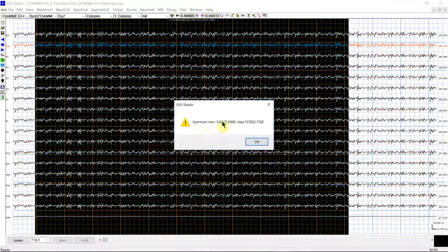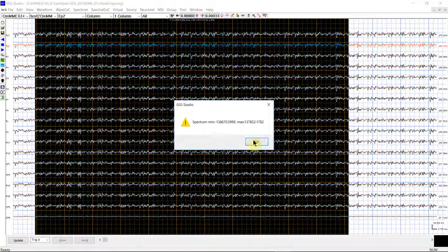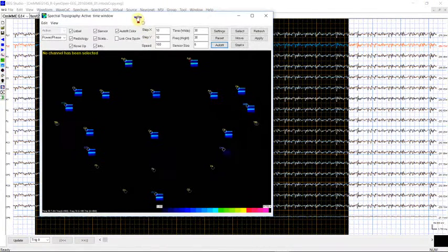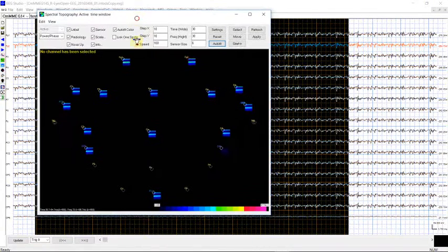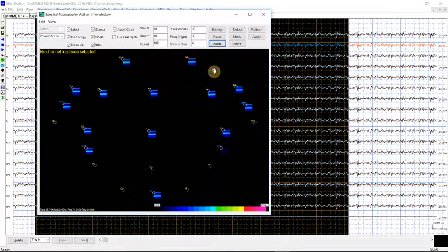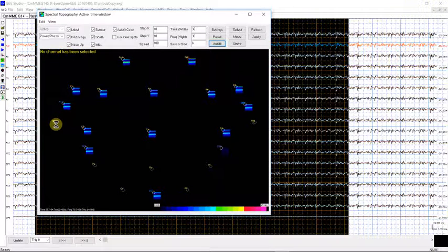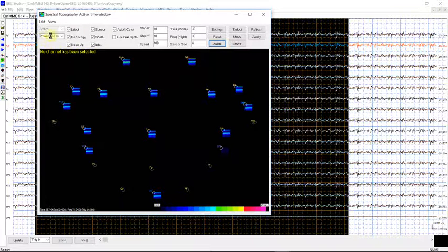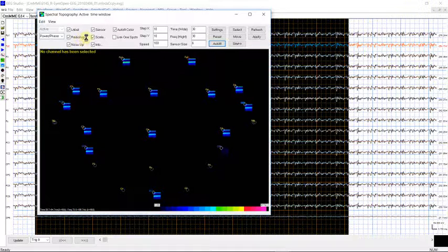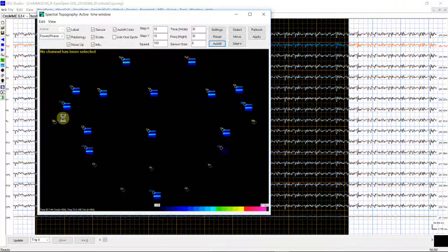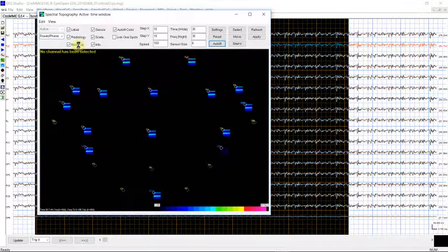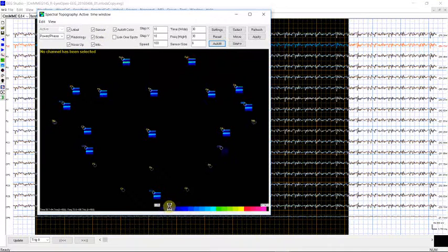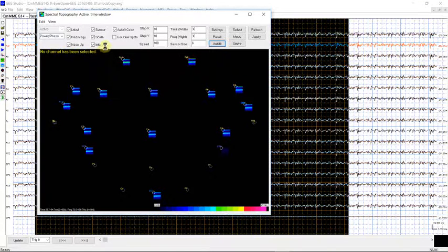And then it tells you the range of the spectral power. See, this is the spectral power. This is each of the channels which has the spectral power, and here shows the power. This is the label, that means the name of the channels. Here is the radiology, that means the left and right orientation. Here goes up or down. We can show the sensor, we can show the scale. The scale is here, the color scale, and we can also use it to show the information.